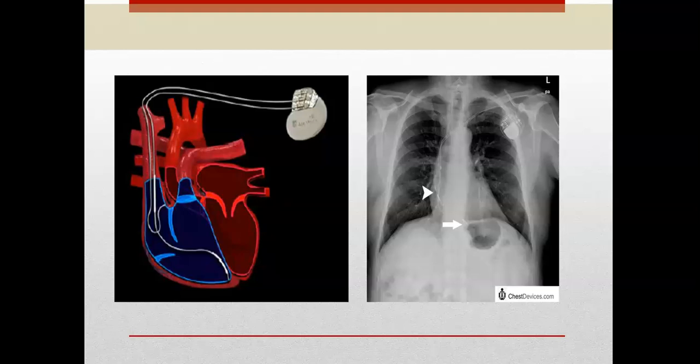Okay, so first off, we're going to start talking about pacemakers. The goal of pacemaker therapy today is to simulate as much as possible a normal physiologic cardiac depolarization and conduction. A pacemaker is simply an electronic device that can initiate the heartbeat when the heart's own electrical system can't, or doesn't effectively generate a rate which is adequate to support cardiac output.